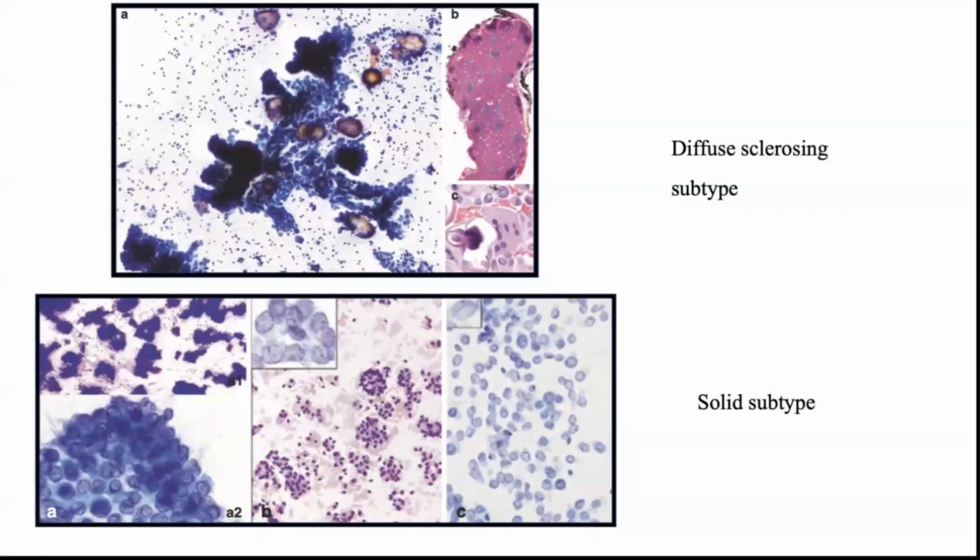Up to 30% of children post Chernobyl accident had a solid trabecular pattern. On histology, they have trabecular and nested areas with papillae or follicles of colloid, and this characteristic feature should be present in more than 50% of the area.